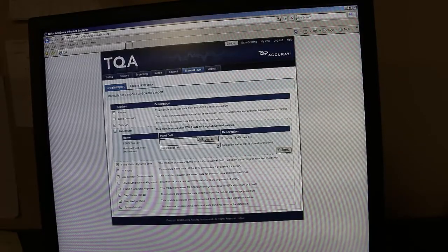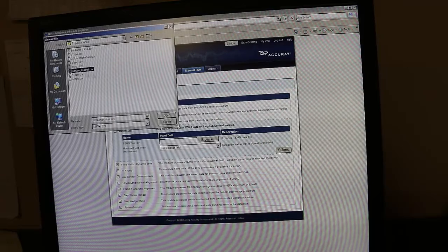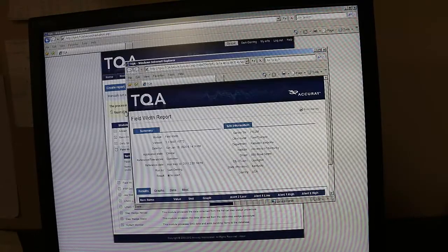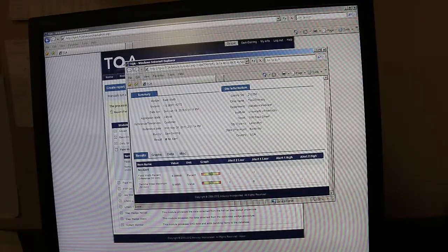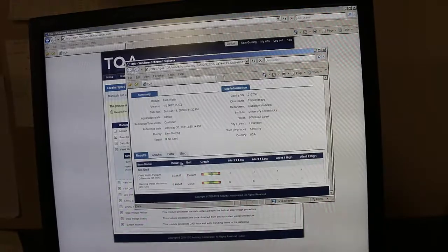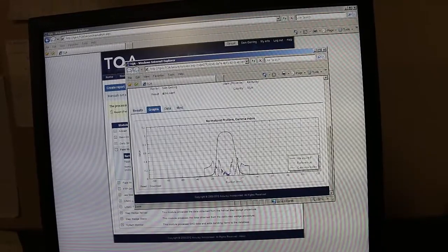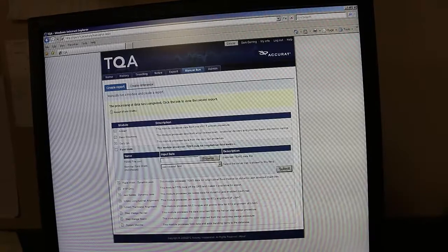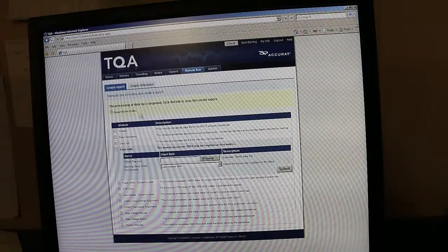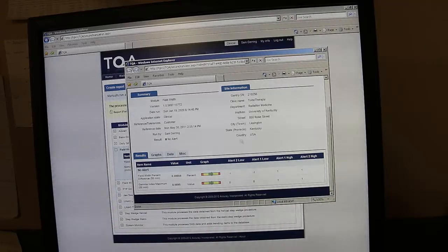And we're going to go down to the Field Width module and select Browse, and then navigate to your thumb drive and find one of the modules you just ran, and then you can get the report for that. And you can repeat that for the other two field sizes and get those reports as well. And that's it.